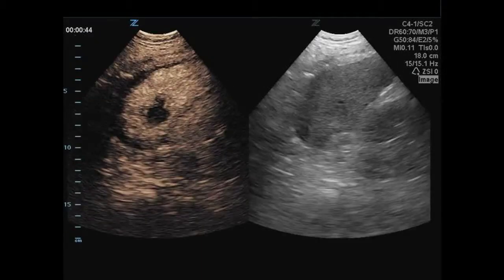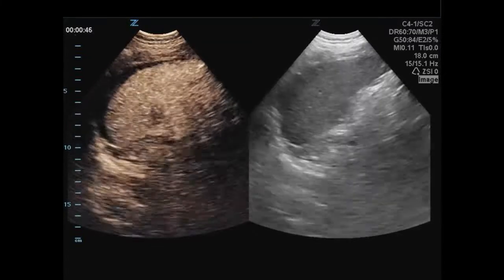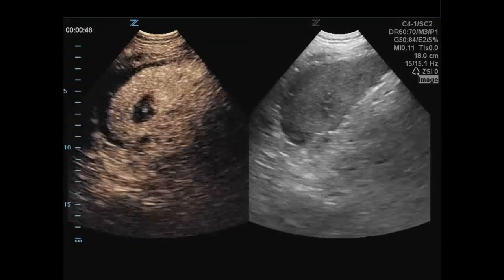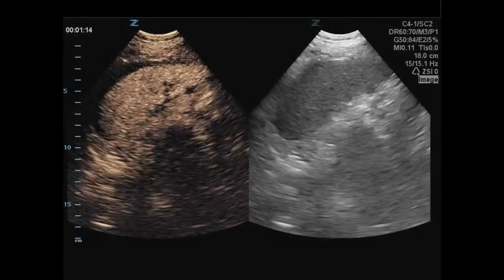But you can see lacerations in the spleen here where we have that blunt injury. This is a patient where we had five patients all in a major trauma accident, and this was the least sick person. So there was free fluid, but we kind of evaluated where that free fluid was coming from. So she got contrast in the trauma bay before we took her up to the OR. And she got triaged to the end of the line considering how injured other people were. But the case is we would never have known that. We would have had to wait for after CT.